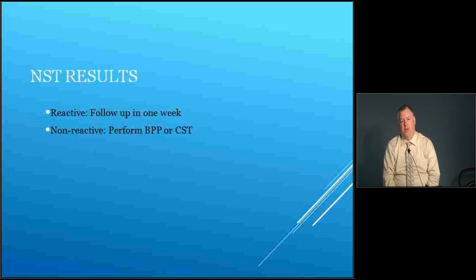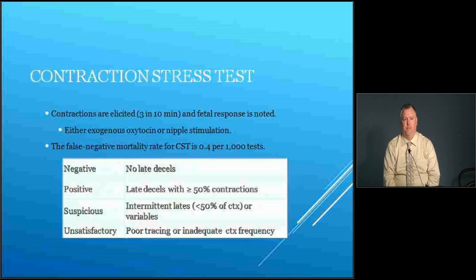So our NST results, when we end up, we're going to have either reactive or non-reactive. If it's reactive, then the recommendation is that you follow up testing within a week. If we get a non-reactive NST, then we're either going to perform a biophysical profile or a contraction stress test.